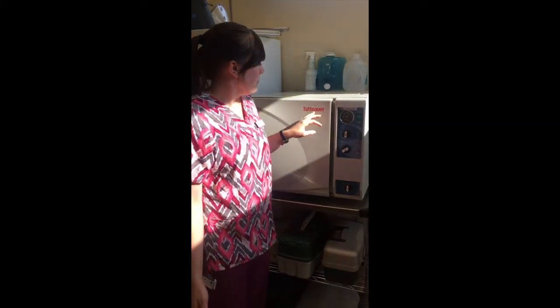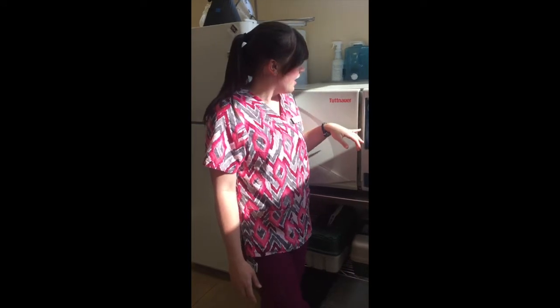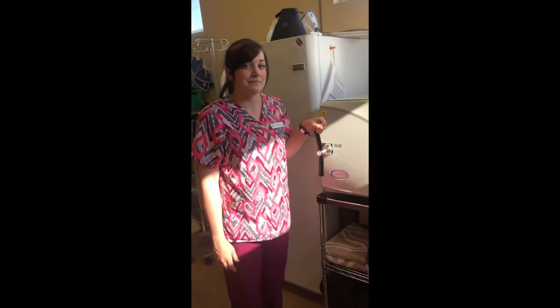The PSI is the same. It does get to about the same PSI. The time though is we set it for 60 minutes instead of 15 minutes, along with the same 20-minute drying process. So that's the proper time and temperatures for autoclaving.